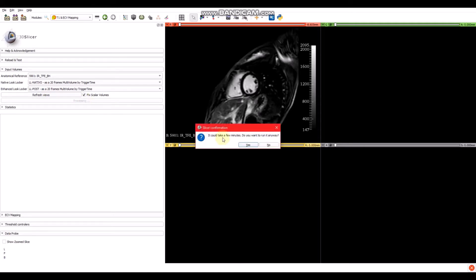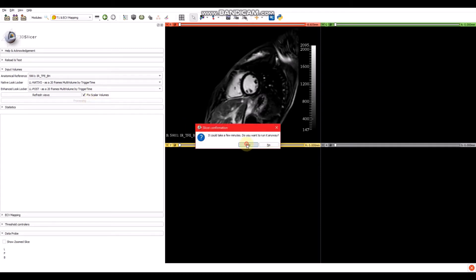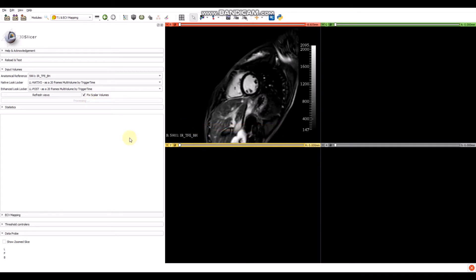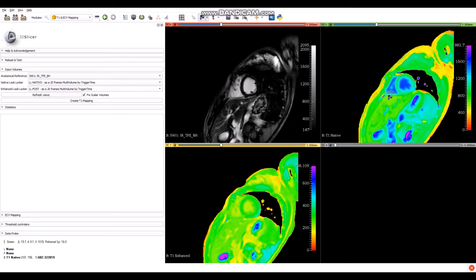After this, we have to click on 'Create T1 Mapping'. We have a warning message — it could take a few minutes. Do you want to run it anyway? If we click on no, it won't run the program. We can try clicking on yes. It will take about three minutes for the program to process the data. After three minutes, we have the T1 native volume and the T1 enhanced.